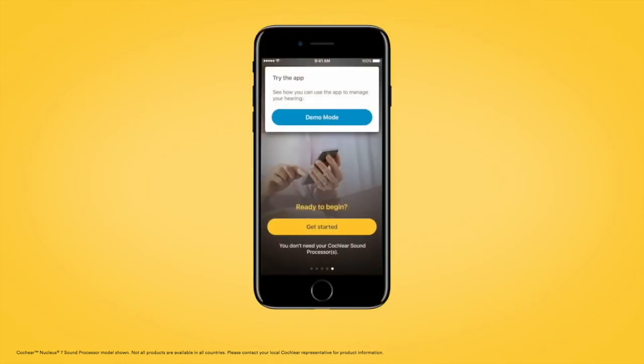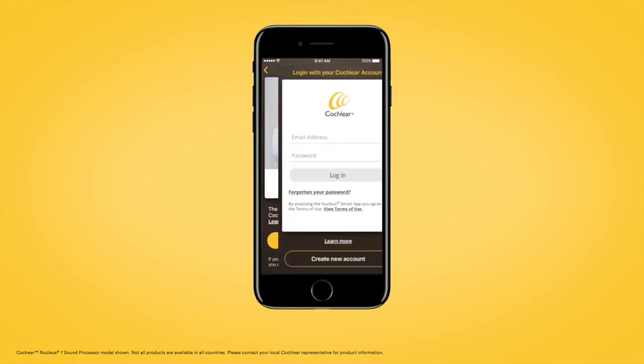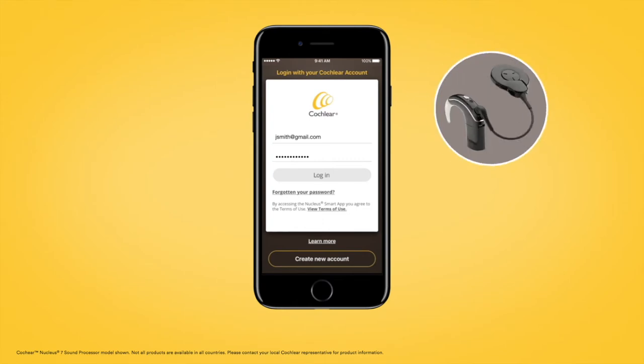To start using the Nucleus Smart App, log in with a Cochlear account. We recommend that you do this before your initial activation, so that you're ready to use the Nucleus Smart App when you receive your Nucleus 7 sound processor.